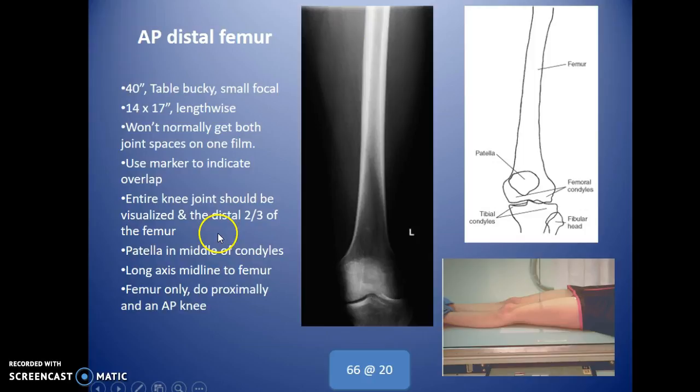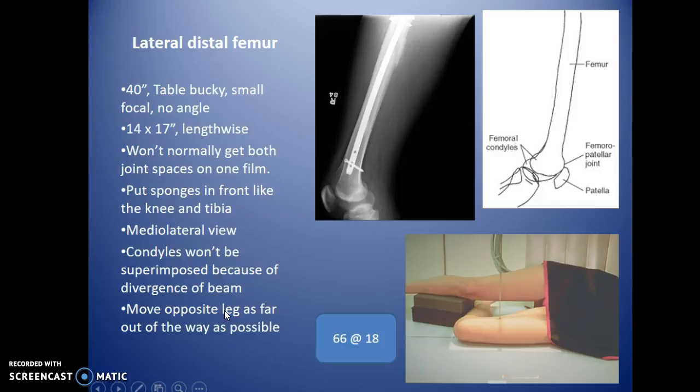The entire knee joint should be visualized in the distal two thirds of the femur. The patella should be in the middle of the condyles, just like on an AP knee. The long axis should be along the midline of the femur. For the proximal femur, image from the hip all the way down as far as you can — you'll get about two thirds of the femur, then include an AP knee.